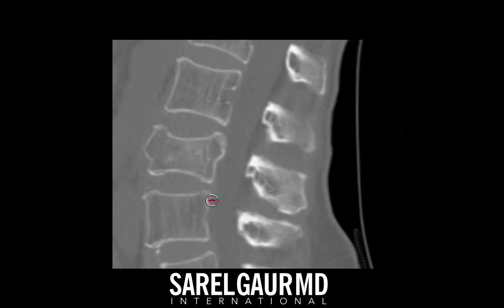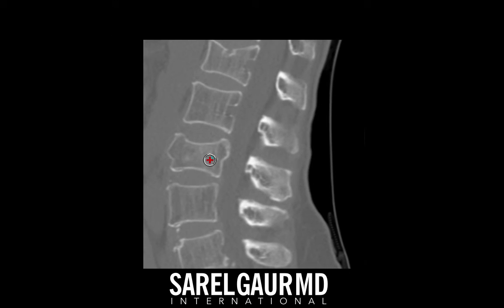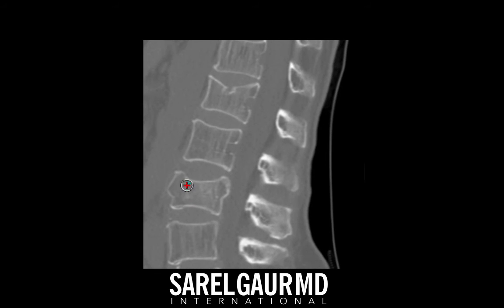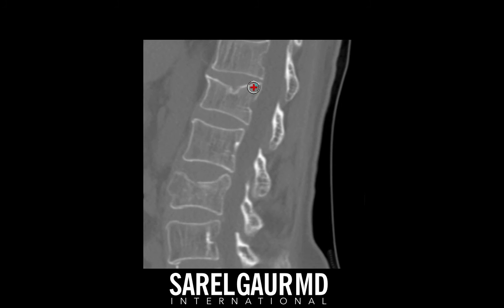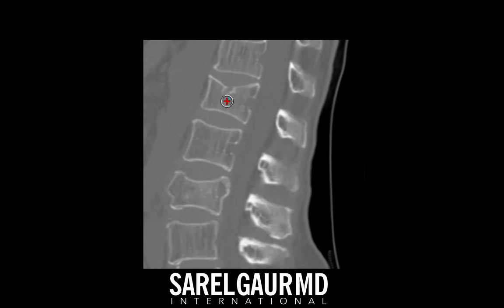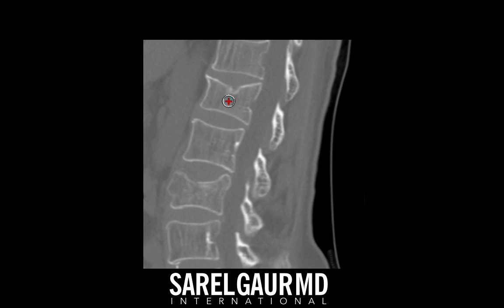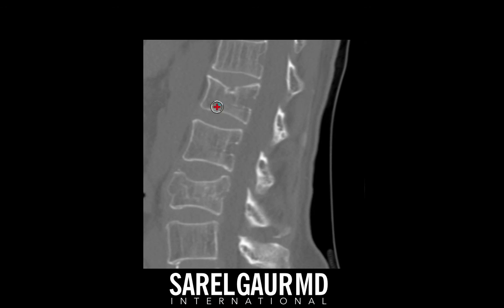Another important thing: when you see one level affected, always look for a second fracture. There's definitely a bit of satisfaction of search — as soon as you see a fracture, you think that's it. But you always want to look at every other level for any other height loss or fracture. Coming up, I'm noticing that at the L1 level there is some mild loss of height, more on the anterior aspect — this is a probable wedge compression deformity. But as I scroll back and forth, this looks like a chronic finding because there are no acute fracture line lucencies.